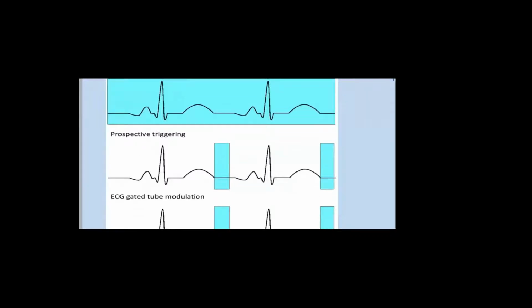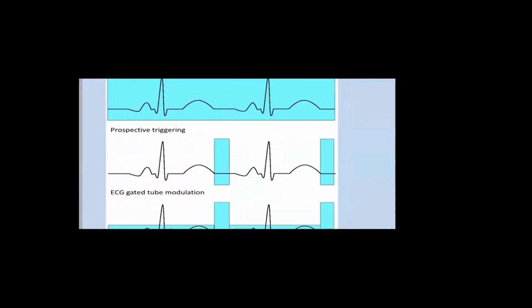You see here, this is quick, we won't dwell so long on this. You hear about gating. Gating means you adjust your scanning to ECG. So there is synchrony between image acquisition and ECG. Non-gating, you don't have that synchrony. In cardiac CT, we have synchrony, and that's important. This synchrony is so important to eliminate the motion artifact.